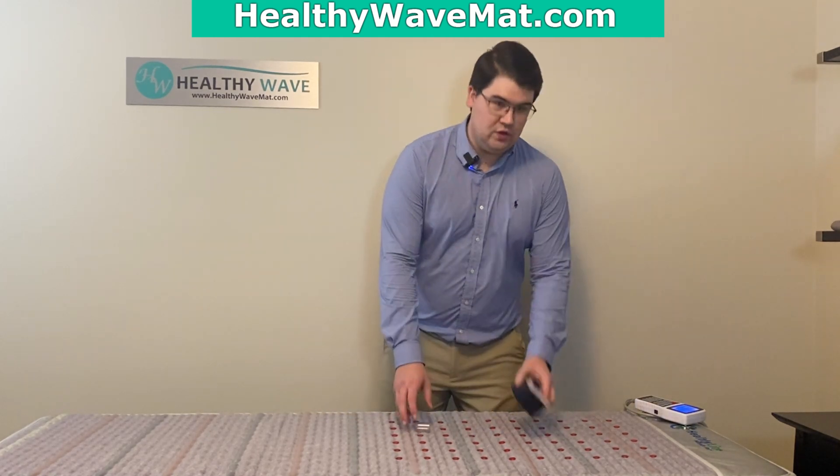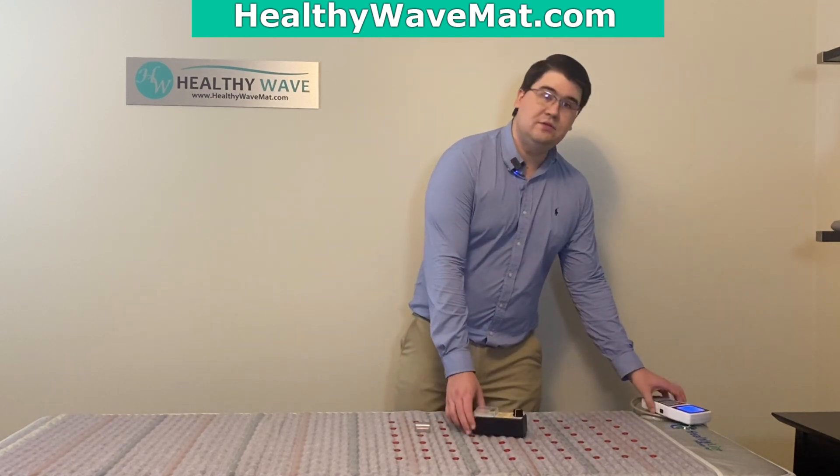In this video I'll be showing how to do the PMF testing on the HealthyWave multi-wave healthy wave mat, showing how to do it with a PMF tester using a gauss meter and also just by looking at the controller, as well as showing you where the coils are located on our pro mat, which has eight coils.